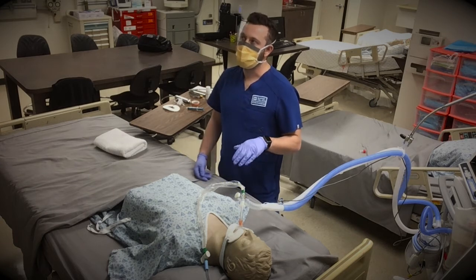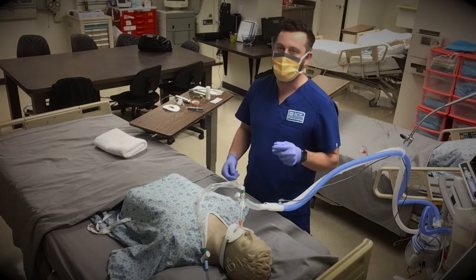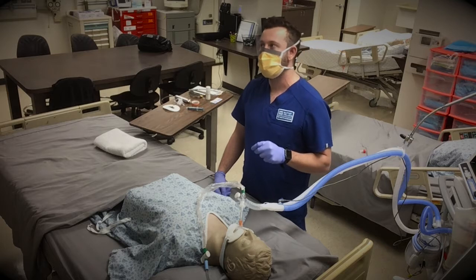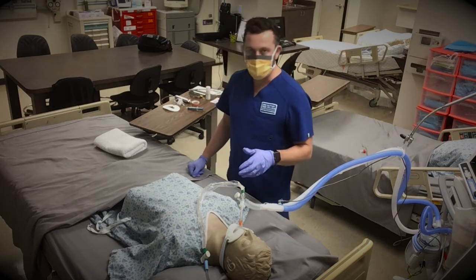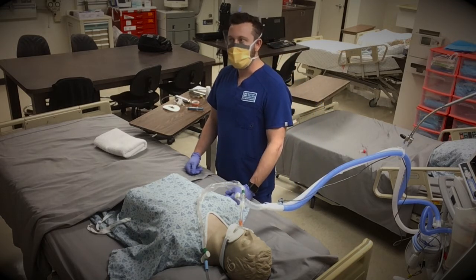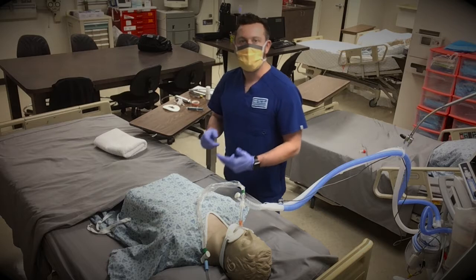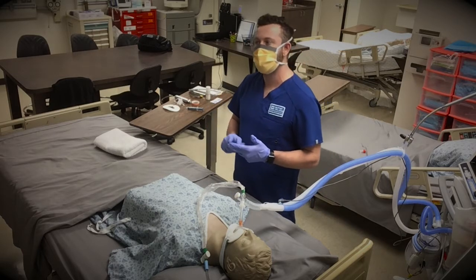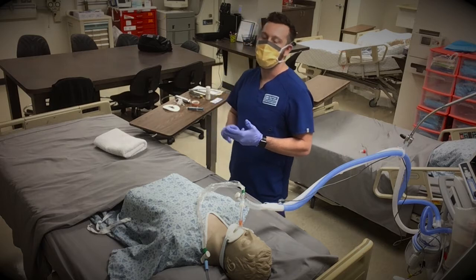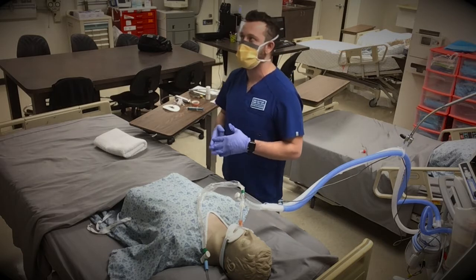Now, to maximize the likelihood of successful extubation, the patient should be capable of maintaining a patent airway and generating adequate spontaneous breaths. Now I'm going to review with you some contraindications to extubating your patient. There are no absolute contraindications to extubation. However, some patients may require one or more of the following to maintain acceptable gas exchange after extubation, like non-invasive ventilation, CPAP, high-inspired O2, or you may have to re-intubate your patient, depending on the situation.